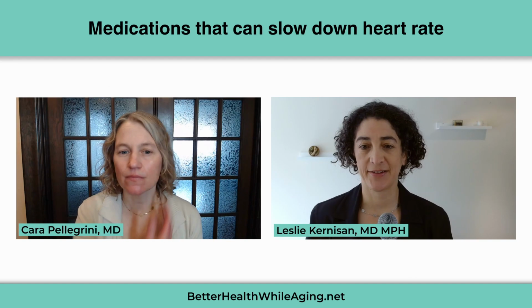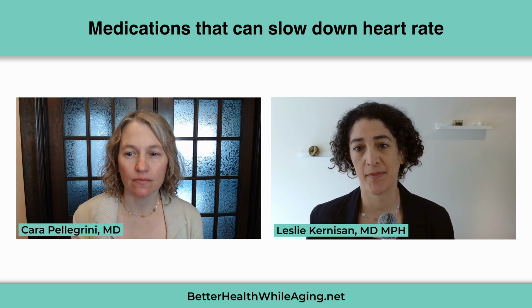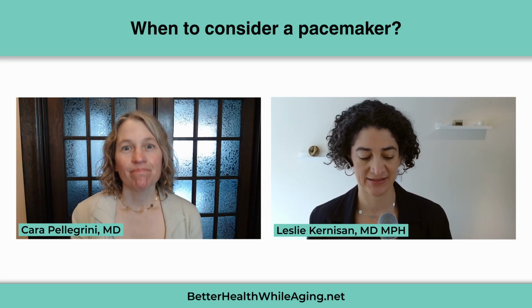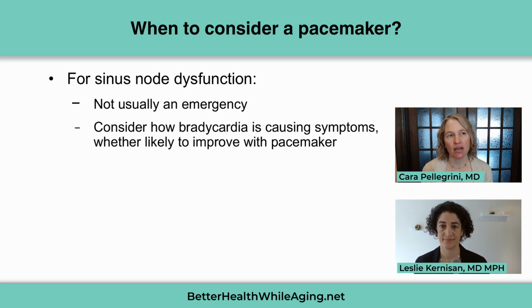Okay. And so, as you said, after you look for reversible causes, you might try to adjust medications, see if you can get a person's heart beating fast enough for their needs. At what point do you decide to consider a pacemaker? Yeah. So definitely for sinus node dysfunction it is not considered an emergency, and really is a discussion between the person I'm caring for and myself, where we spend some time trying to suss out how likely we think a pacemaker would make this person feel better.